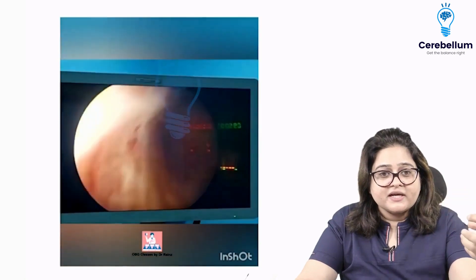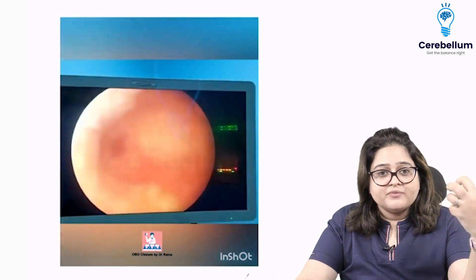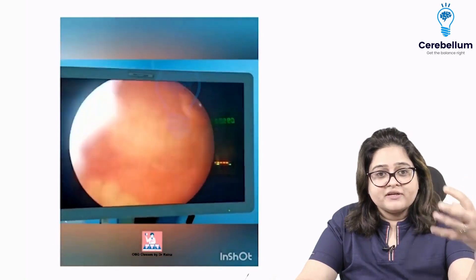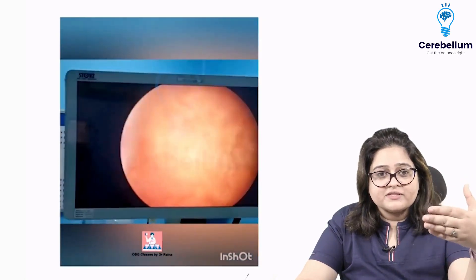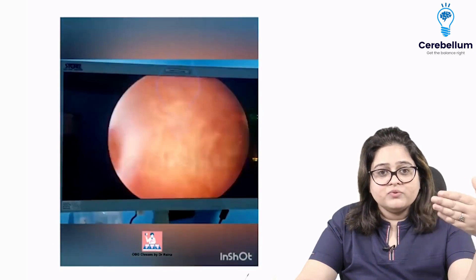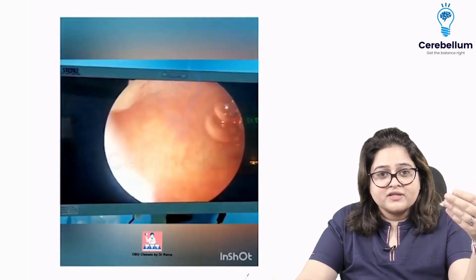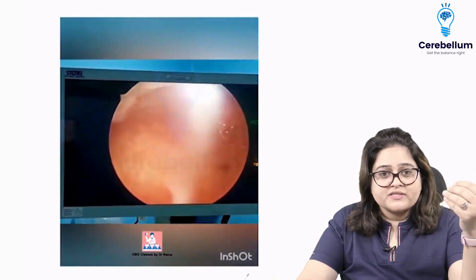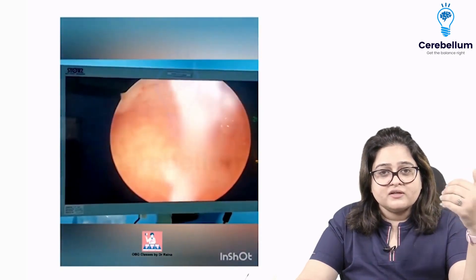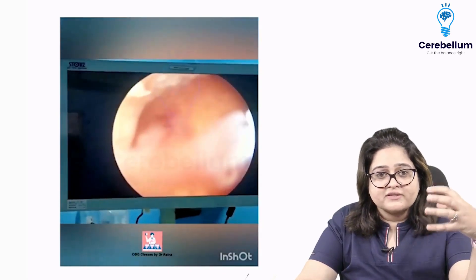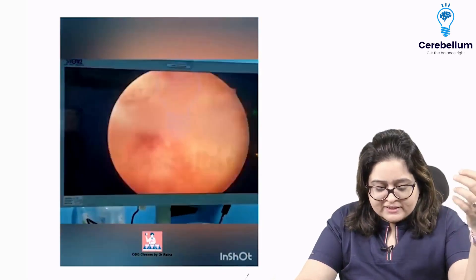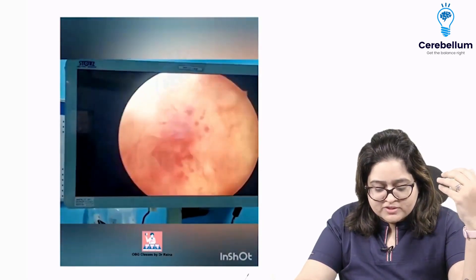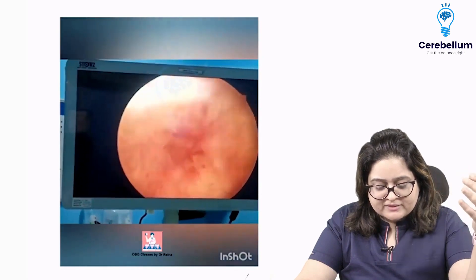Going inside and I'm reaching the fundus — the top. You can see now I'm at the fundus, and if you see on both sides laterally, you can see the ostea through which the tubes originate. That's the tubal ostea of one side, and that's the tubal ostea of the other side.